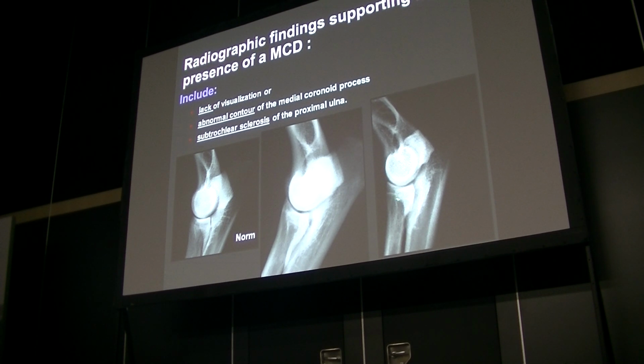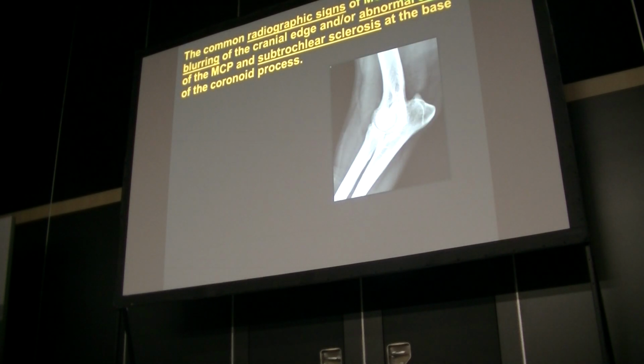This one, it's a tricky one. We can try to follow the delineation of the coronoid process. However, it's not triangular anymore. It's not concave. There's a bump, a bulge, meaning that also this coronoid process is abnormal. So these are really subtle findings that we are dealing with to help us make up our diagnosis.